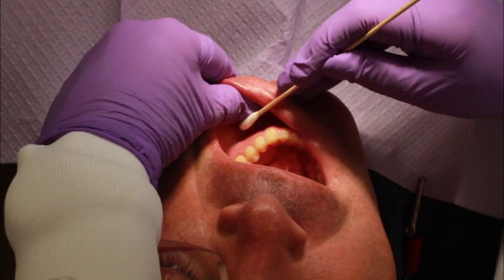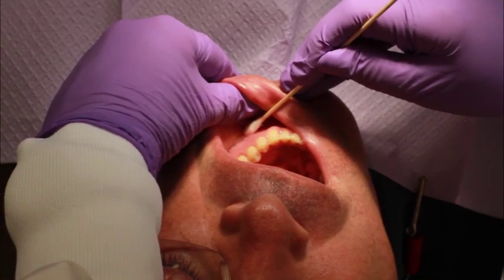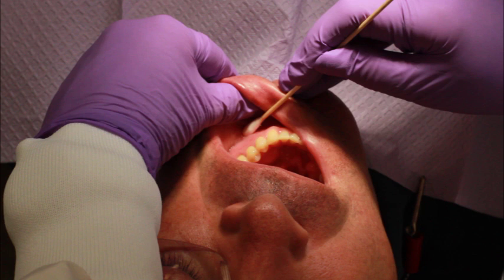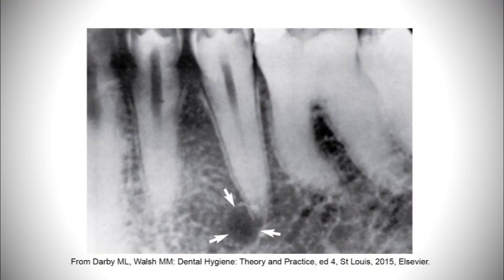The deposit location or target area for the mental block and incisive block is anterior to where the mental nerve enters the mental foramen to merge with the incisive nerve and form the inferior alveolar nerve. The mental foramen is usually located on the surface of the mandible between the apices of the mandibular first and second premolars. The mental foramen in adults faces posterosuperiorly. You can locate the mental foramen on a radiograph before performing the block to better determine its position during palpation.